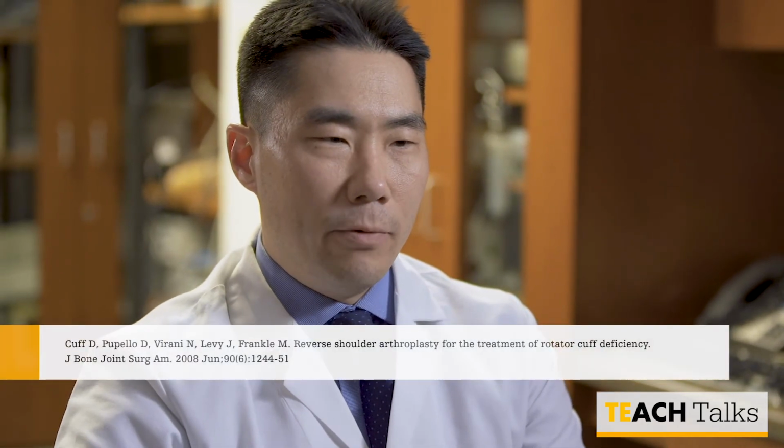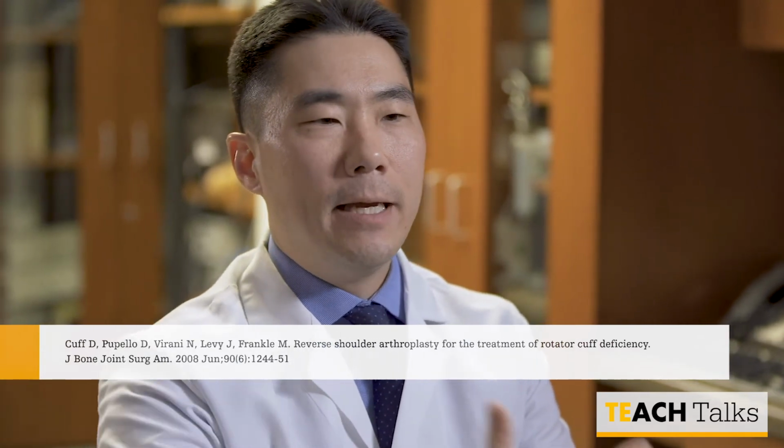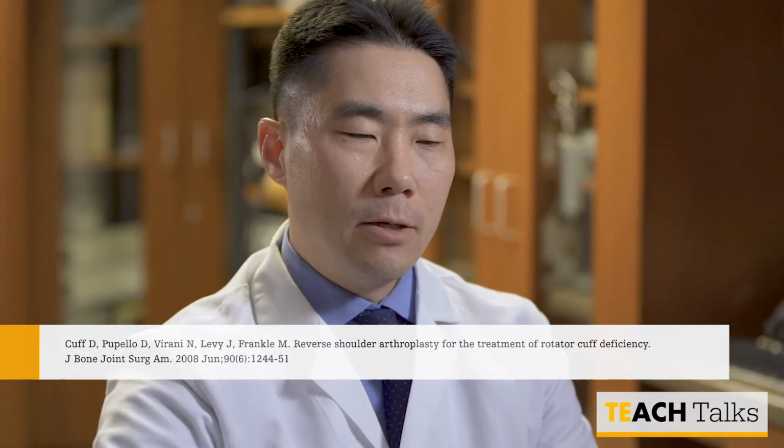Well, if we lateralize our center of rotation, we can tension the posterior rotator cuff and get our active external rotation. If we lateralize the center of rotation or lateralize our glenosphere, we can potentially improve the cosmesis, a more rounded shoulder instead of the boxy shoulder, a more normal arm length than the longer arms that I personally have seen in medialized center of rotation implants.